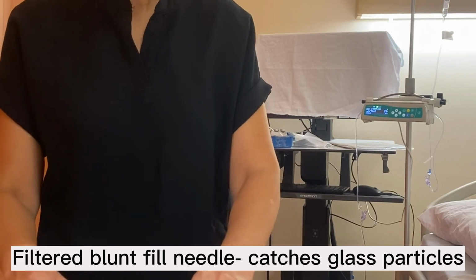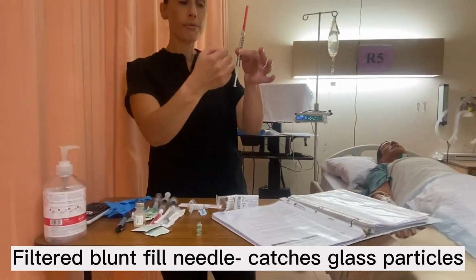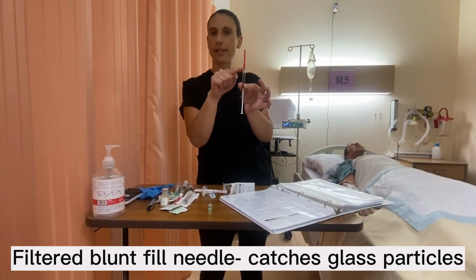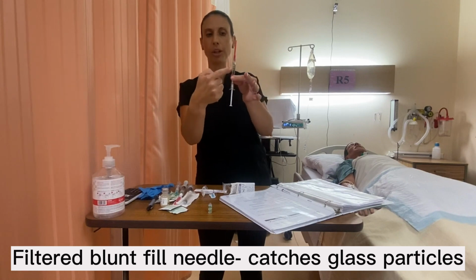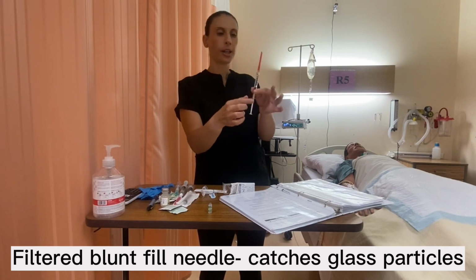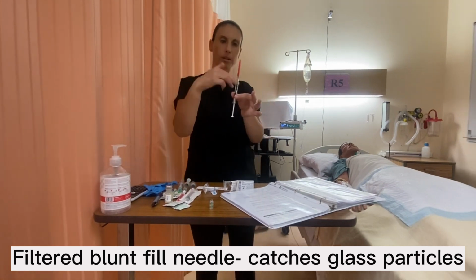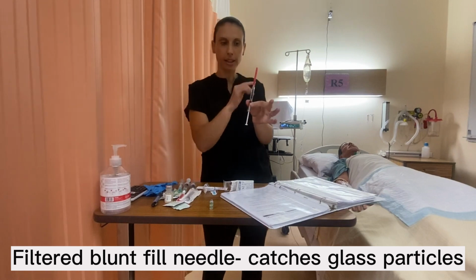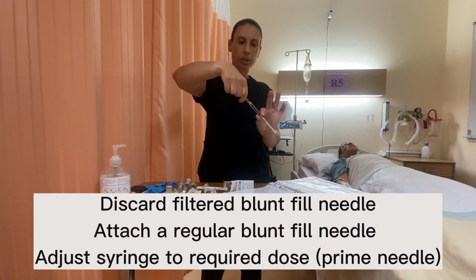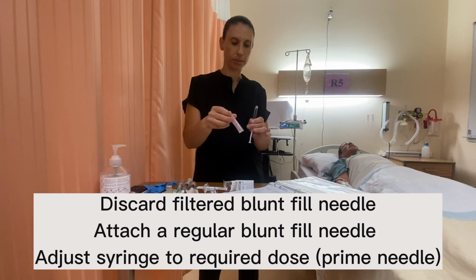Okay. So now with the filtered blunt fill, I have pulled back. So if there was any glass particles, it would get stuck inside this little filter. So then that way no glass particles ended up in my syringe, thankfully. Okay. So I would never want to push or inject this medication into anything, because if a glass particle was in there, it's going to get shot out the needle. So what I'm going to do is switch now to a regular blunt fill.